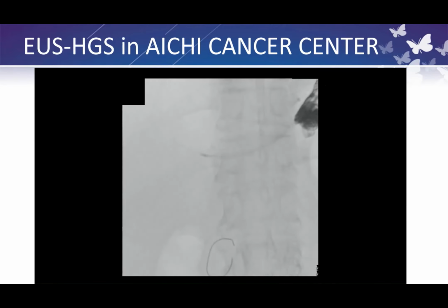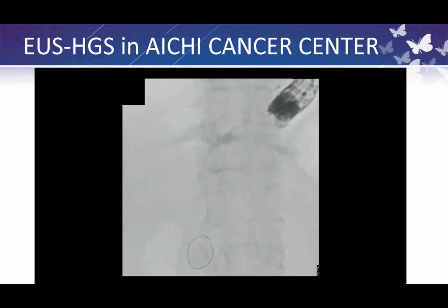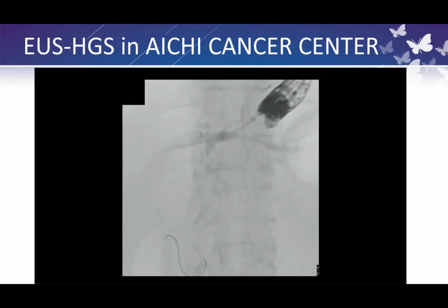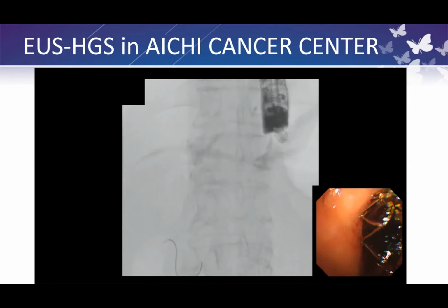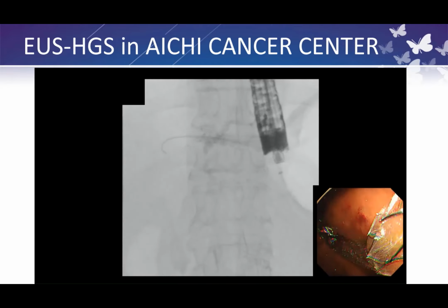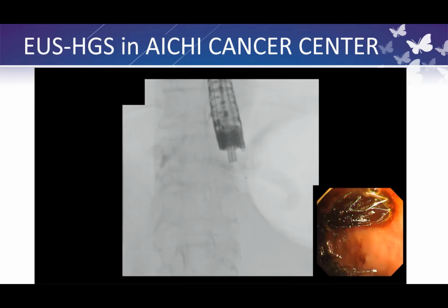This is a dilator. This dilator is an ES dilator with side hole. We can aspirate through the side hole and inject the contrast medium. And finally, we put the metal stent. This metal stent is so tapered, so insertion is very easy. And we open the metal stent in the bile duct, and open the stent in the biopsy channel, like this. And finally, we push out the metal stent in the stomach. And we can see the metal stent easily because this scope is a forward viewing scope.